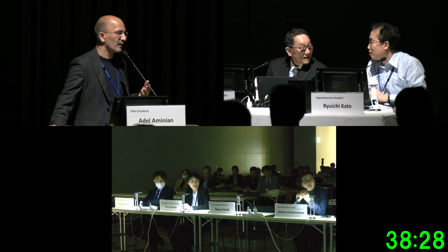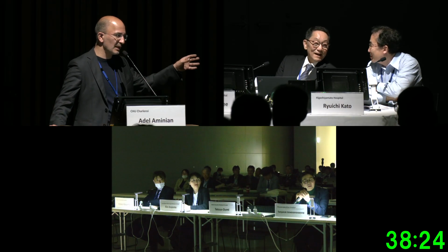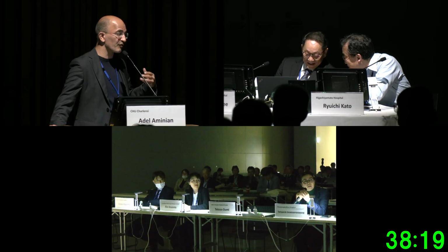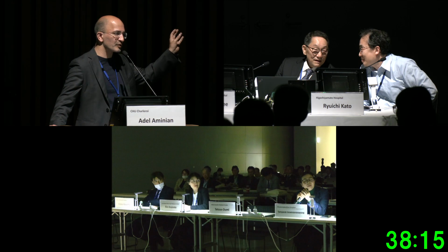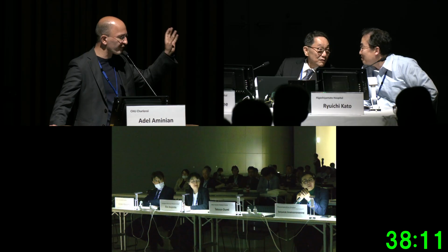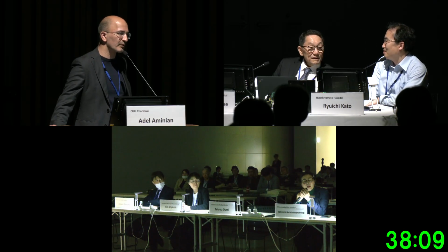So what do you lose by using echo? If you have an echo machine in the lab, I think there's a gradient. I will talk about that tomorrow. There's a gradient about the use of echo, like a hierarchy. For femoral, it should be almost 100%. For distal, probably a lot. For conventional, probably less. But for femoral, I think it's really the way to go.